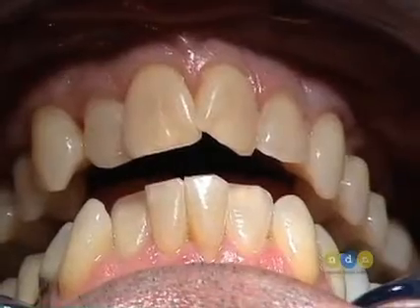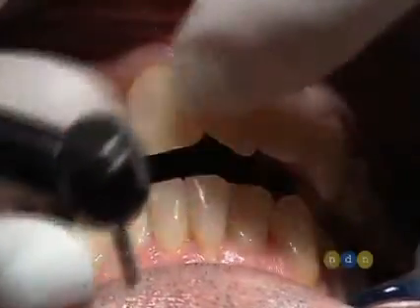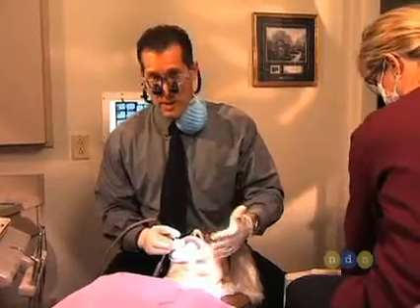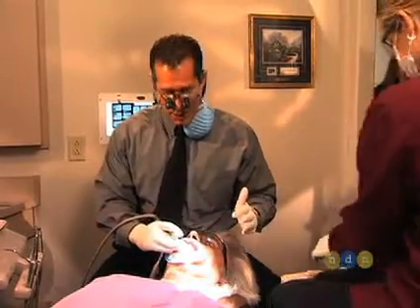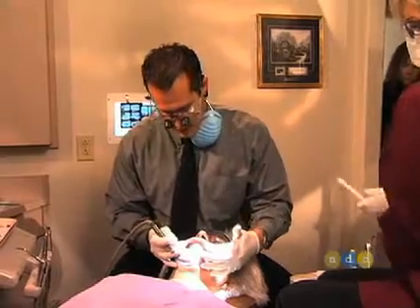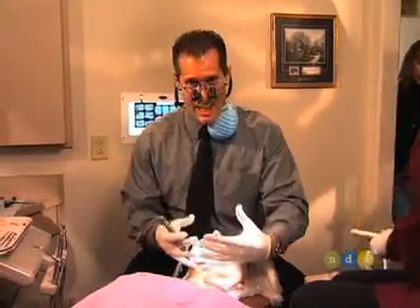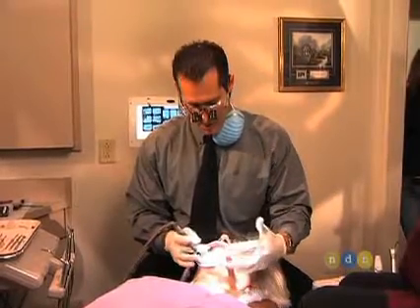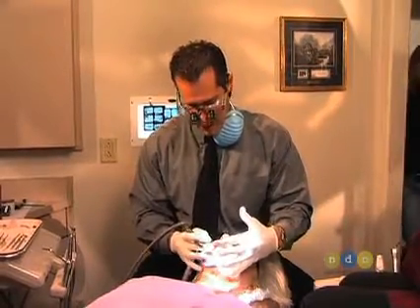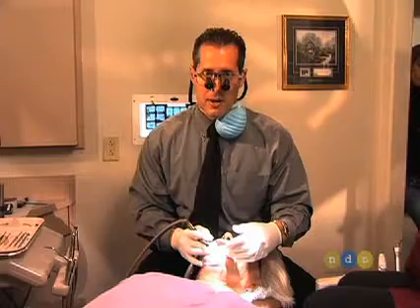He wanted a significant change. In all cases, whether they're this crowded or less crowded or more crowded, what you want to do is create the ideal upper arch form first. By doing that, you're going to make every case very straightforward. If you just look at this case and try to figure out how to attack it and how to really prepare the case, it gets kind of confusing. So I'm going to create a very ideal situation and then think about preparing it.